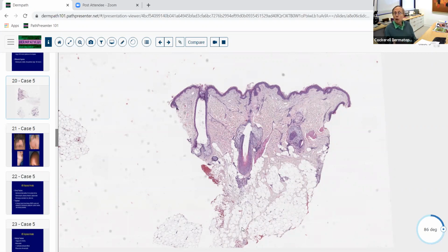If there's scar, where is the scar located? If there's inflammation, where's that inflammation located? Is it present at the base of the follicles? Is it present more superficially, like near the infundibular follicles? Is it diffuse? Same thing with the scar. Is it around the infundibula, like you see with lichen planopilaris? Is it really kind of diffuse, like you see with ruptured follicles with something like folliculitis decalvans? So you're going to ask yourself all those various things.